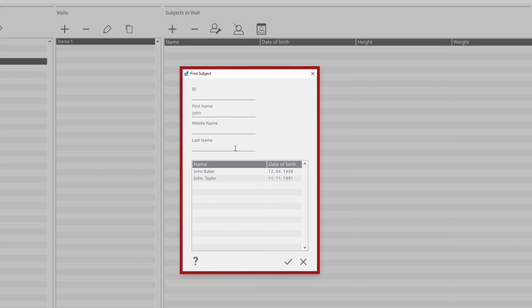If the subject already exists in the database, it will be shown in the table and you can select it. Otherwise, click Confirm to add a new subject.